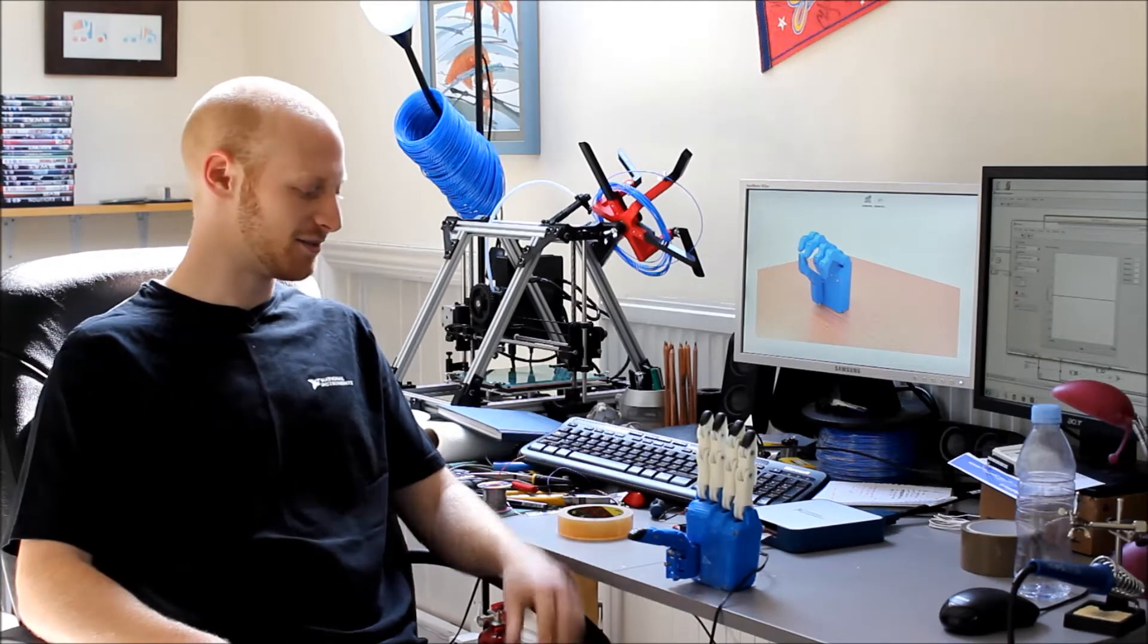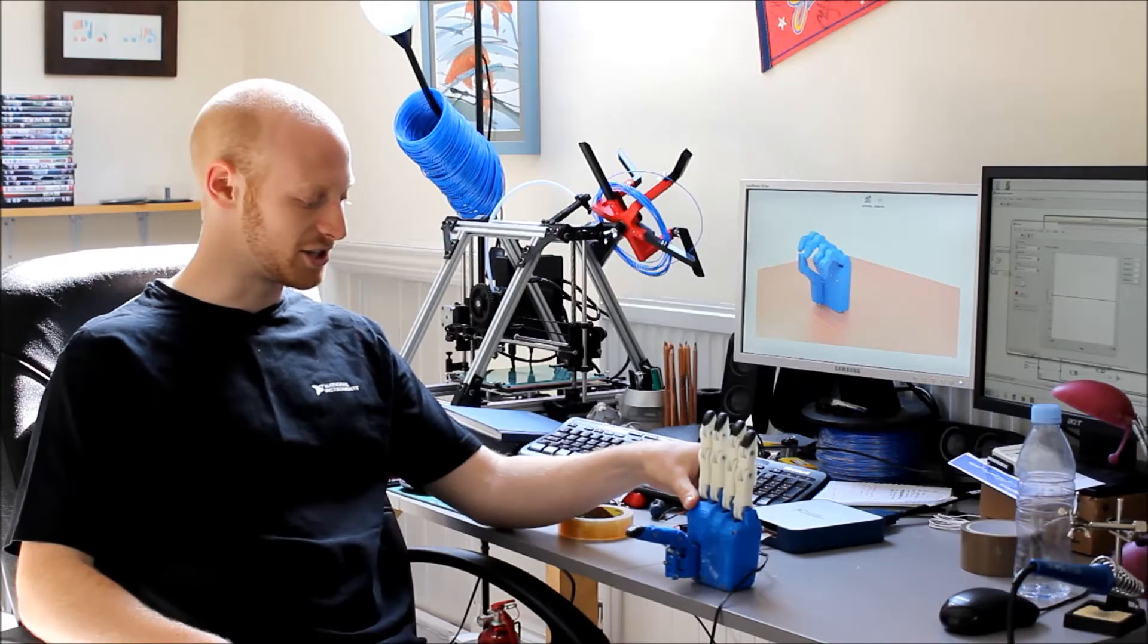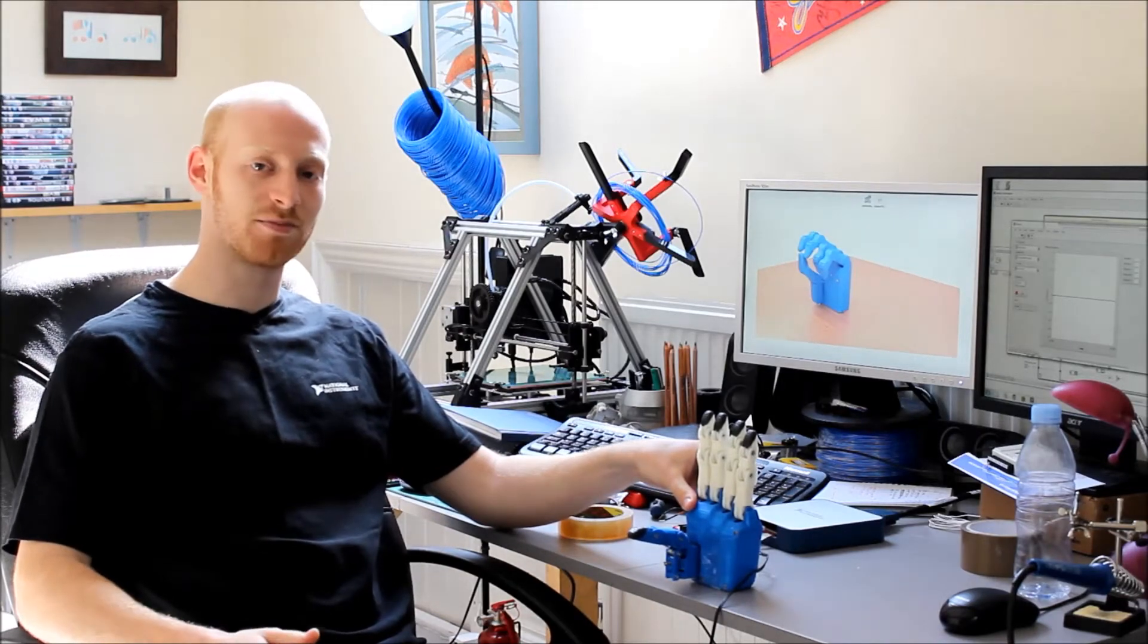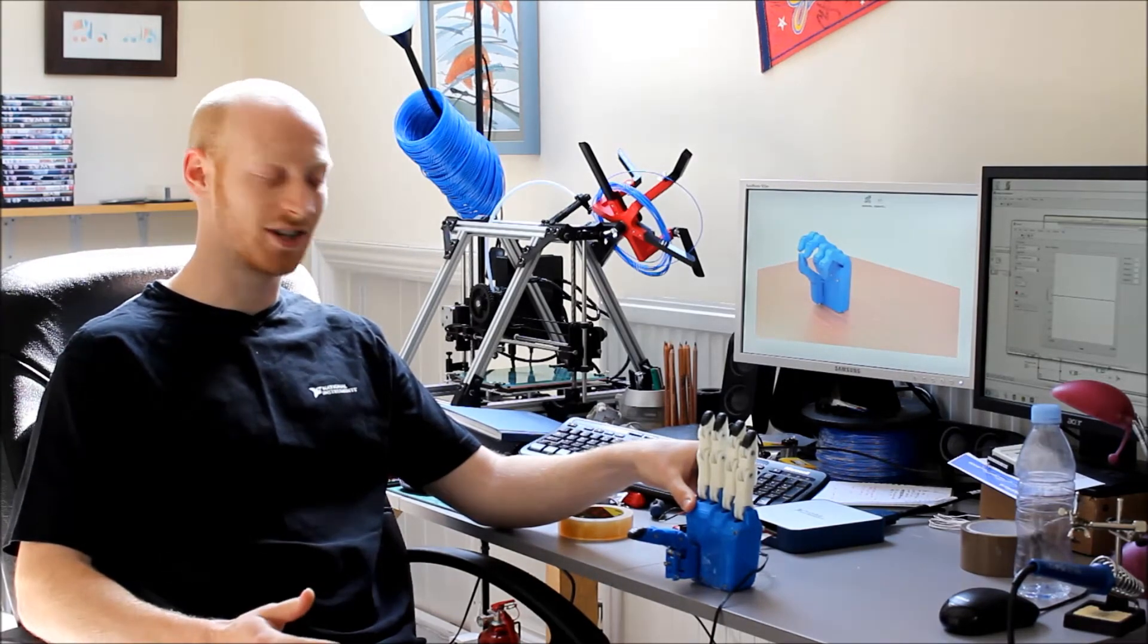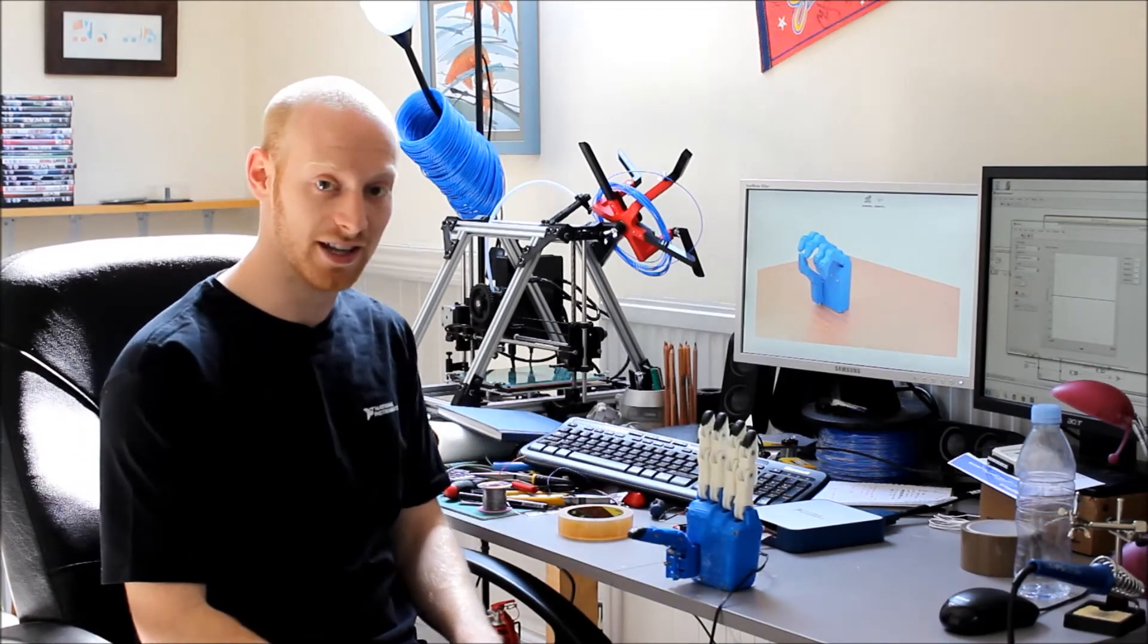Hi, my name is Joel Gibbard and this is an update on the Open Hand Project. And today I wanted to proudly show you the first prototype of the dextrous robotic prosthetic hand, which I have right here.